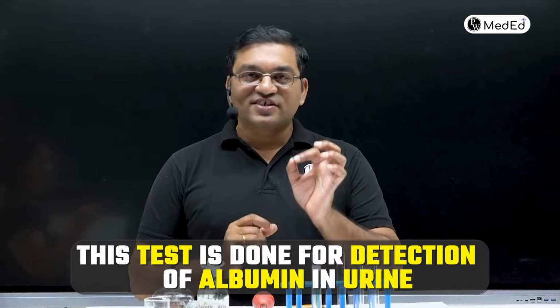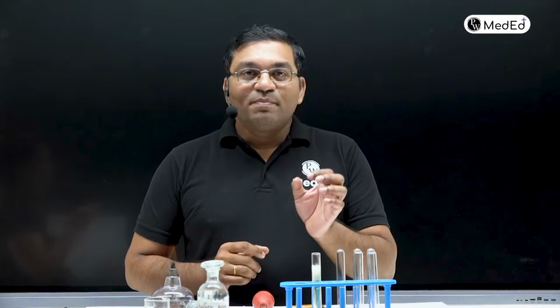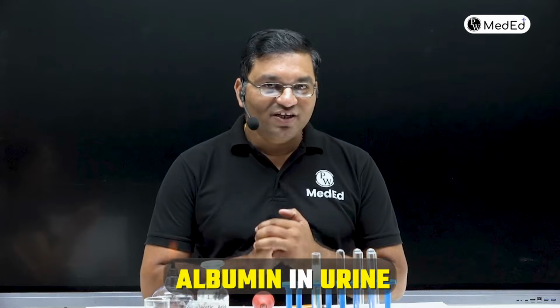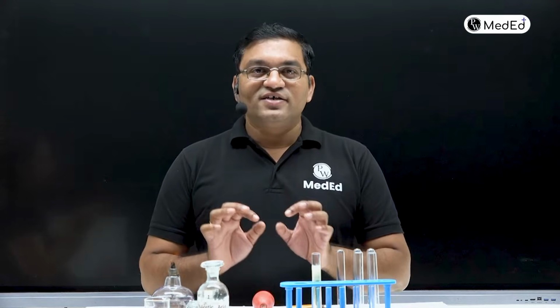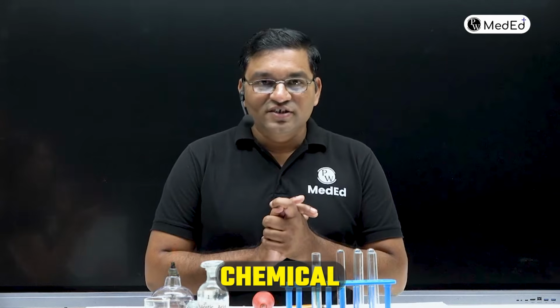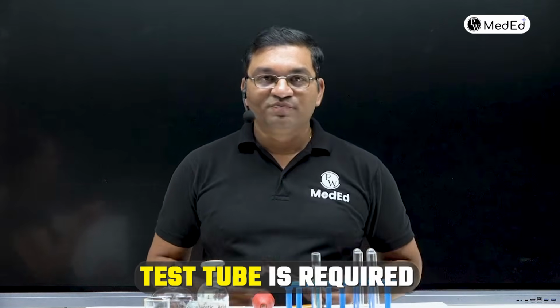Hello students, today's topic of discussion is heat coagulation test. This test is done for detection of albumin in urine, mainly the bedside detection of albumin in urine, as this test generally does not require a chemical. Got it? So what are the apparatus required? Test tube is required. Okay.